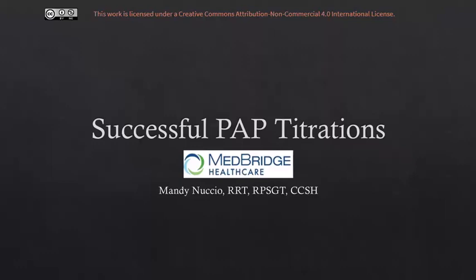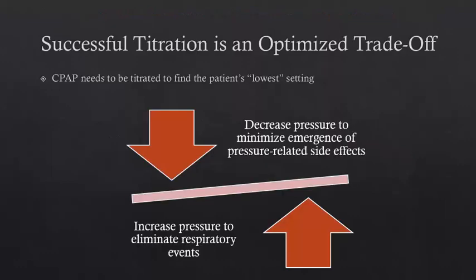Hi, I'm Mandy Nuccio, and I'm going to do a quick review of PAP titration protocols and what we can do to maximize our chances to have a successful PAP titration with our patients.